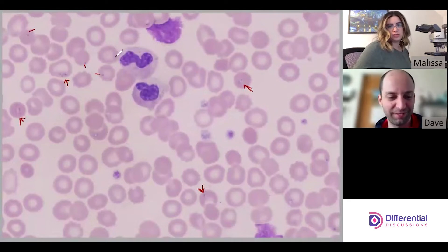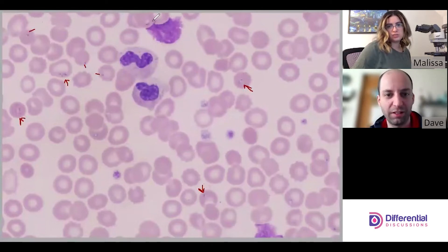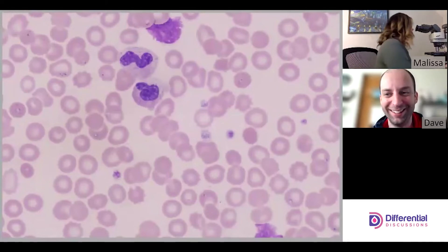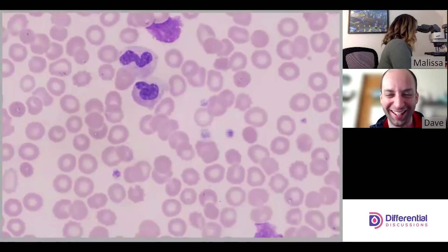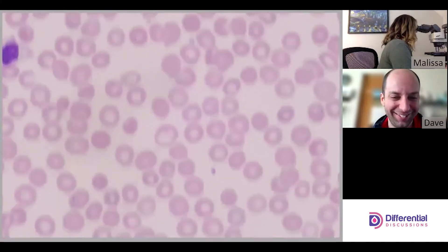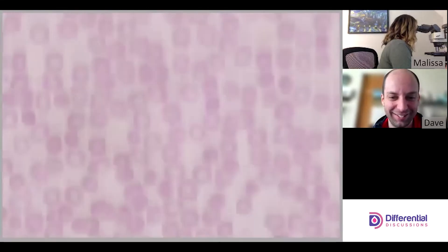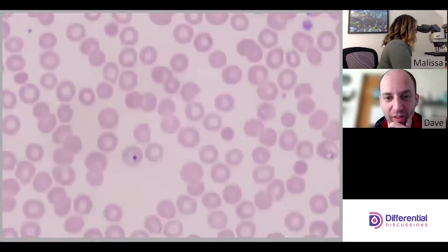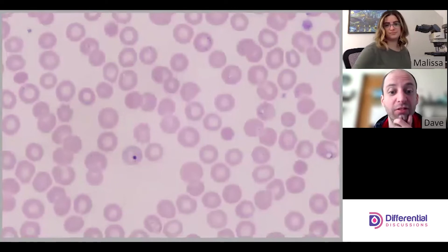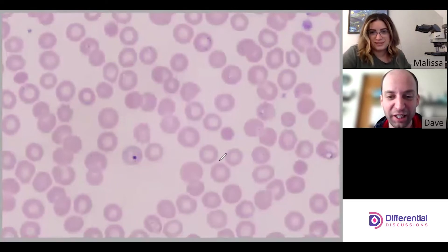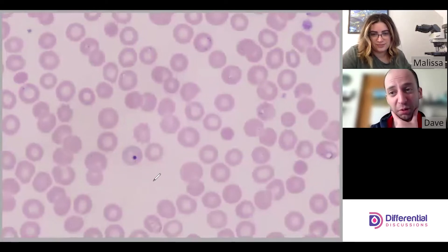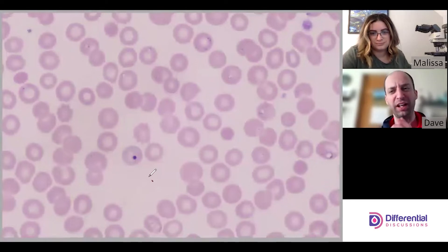There are two neutrophils here and then this is just a smudge cell. Oh — is that a Howell-Jolly body? It is a Howell-Jolly body. So this is a nice segue — what does it suggest when we see a Howell-Jolly body?